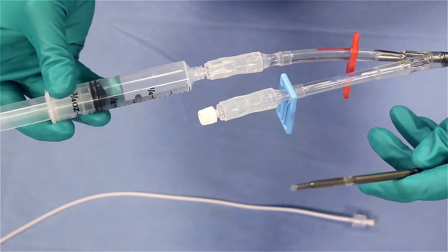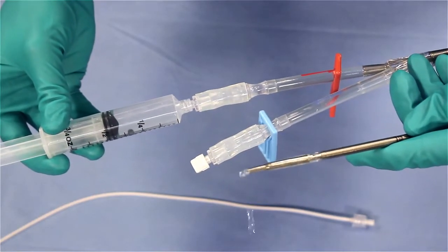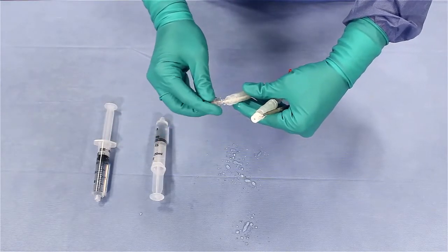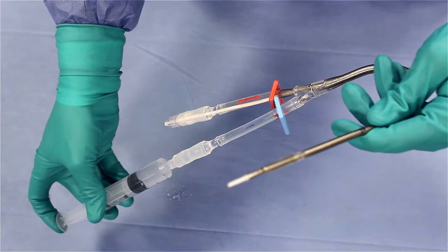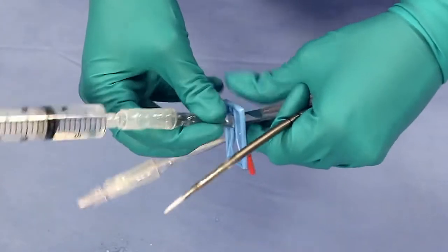Flush the red infusion lumen with 10 milliliters of saline while keeping the catheter tip up. Now reinsert the stylet into the red infusion lumen. Flush the blue drainage lumen with 10 milliliters of saline while continuing to keep the catheter tip up. Clamp the blue drainage lumen when finished.